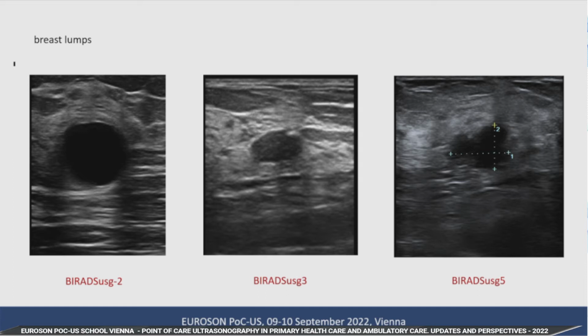It may happen that this lady will have a cancer, or she has a cancer at the moment in another part of the breast. So I'm talking about it to explain that there are two ways of dealing with breast problems. One way is symptom-focused sonographic examination. The second is to examine the whole breast in detail, in case of a little tiny cancer which is not clinically palpable, which we can find only in sonographic examination.